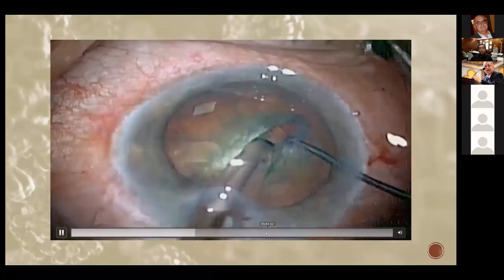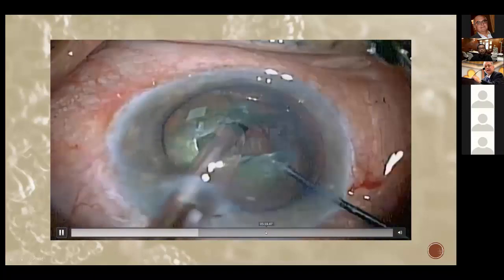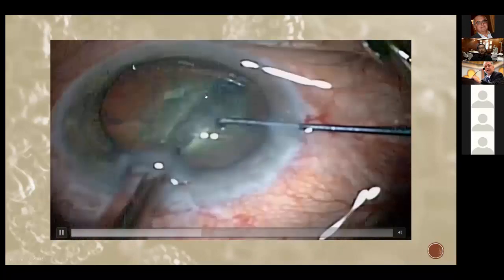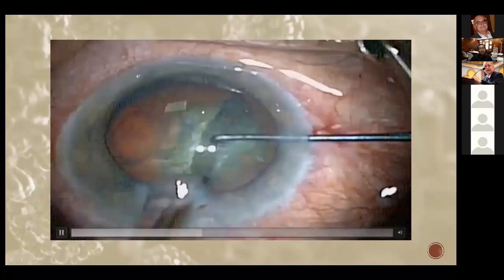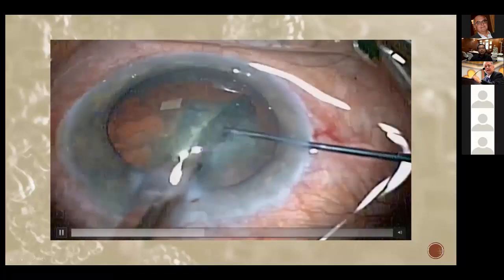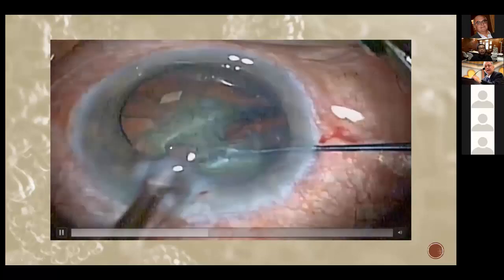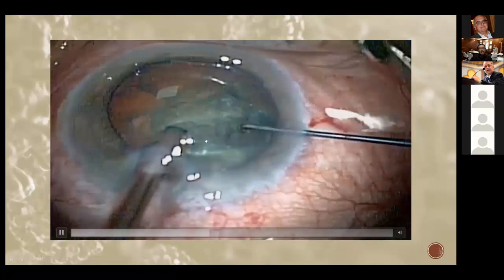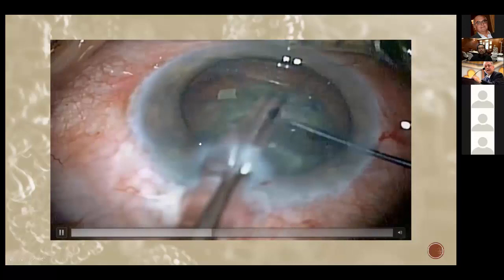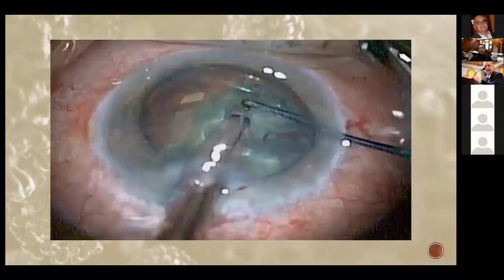So I decided to do the divide and conquer, the technique that I'm more comfortable with and it's reproducible with me. As you can see, I divide from the very peripheral part of the nucleus. And now my division is completed. I will make sure that the division passes all the way to the other side, extending it and doing minimal rotation. Then I'm going to do another quadrant deep enough and then go to the periphery and then divide.